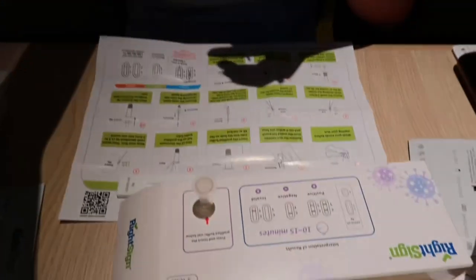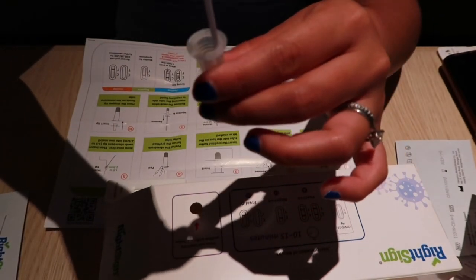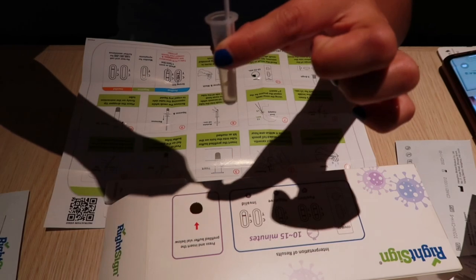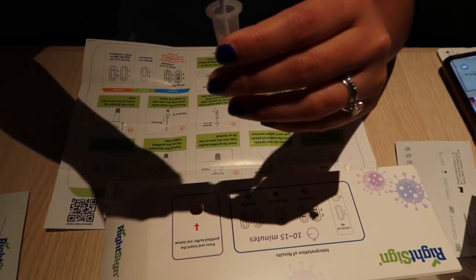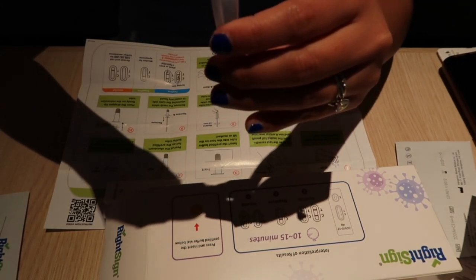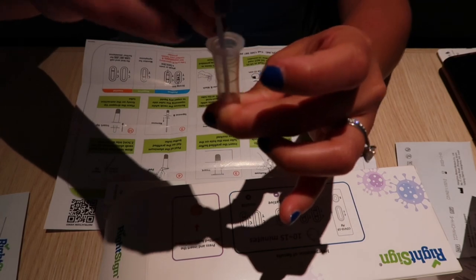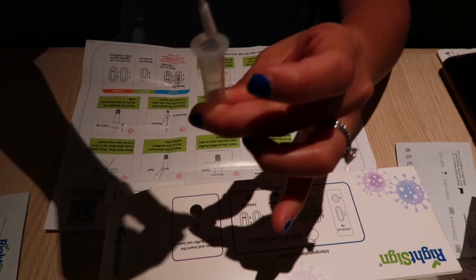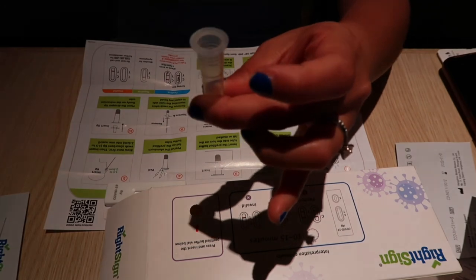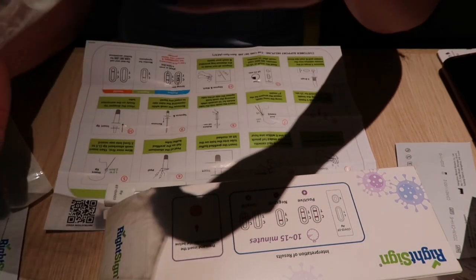Now I have to insert the swab into the tube, rotate it for 10 seconds while squeezing it. That's actually a bit difficult and uncomfortable. Ten seconds — done. Squeezing it out now.